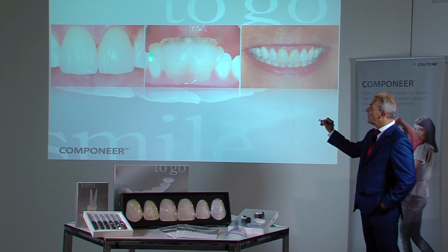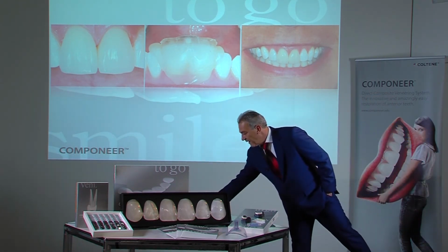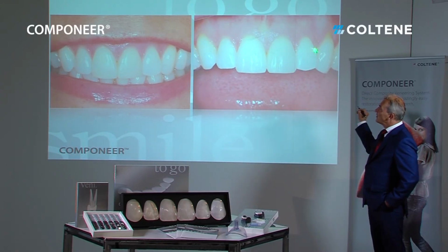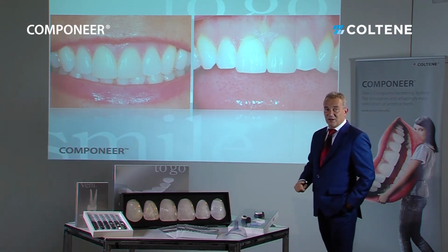You can see the final outcome. Shortly after removing the cofferdam, rubber dam, an overnight protective splint was also prepared, and after 2 weeks one can observe the colour integration with the adjacent teeth. That is the initial situation: a somewhat matte composite restoration, and a final outcome with a bit more character and life.